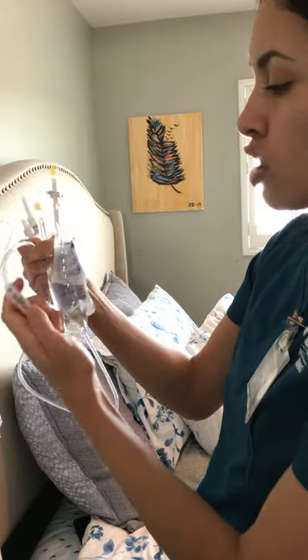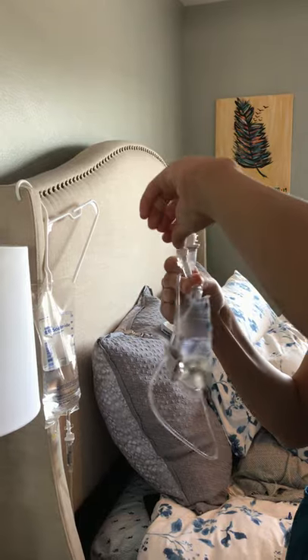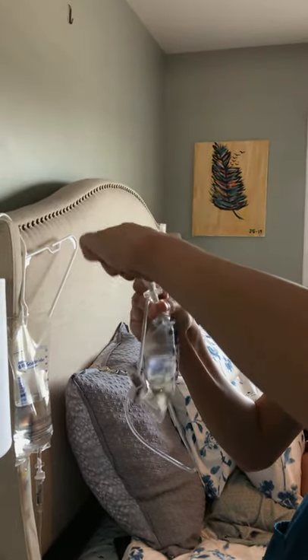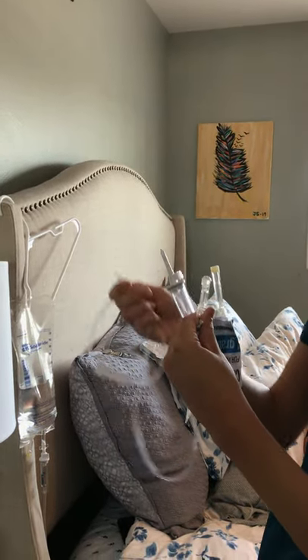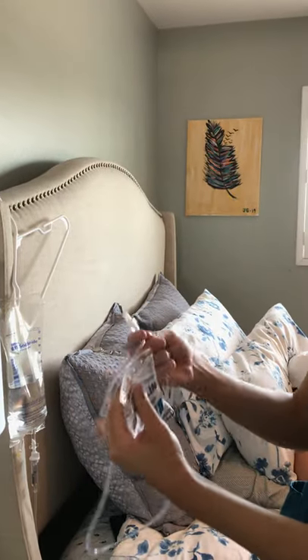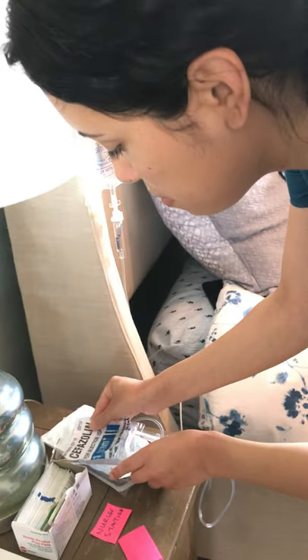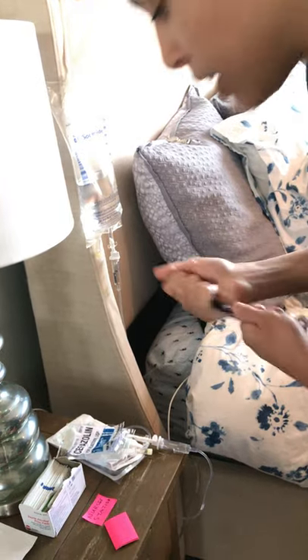Before I get started, I'm going to make sure my clamp is closed — and it is closed. Next, I'm going to remove the cap here, and I'm going to place it down and label my tubing.